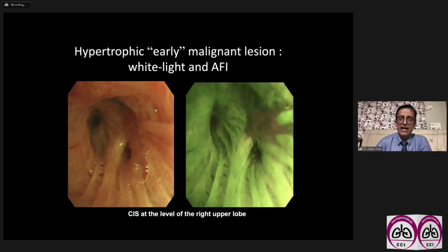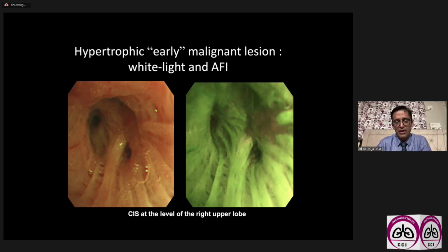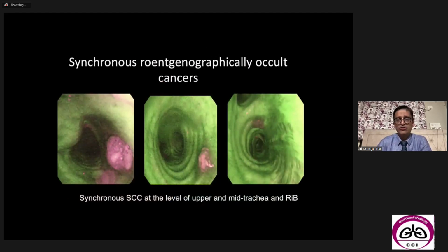The last indication that I wanted to mention was, again, one of the first indications for doing cryo in clinical studies: identification of early malignant lesions by autofluorescence. You could also do this with NBI. You can see the small red lesion on my probe there, and you would ablate this tissue by the use of cryo. So I'll finish off there and I'll hand over to Chetan.